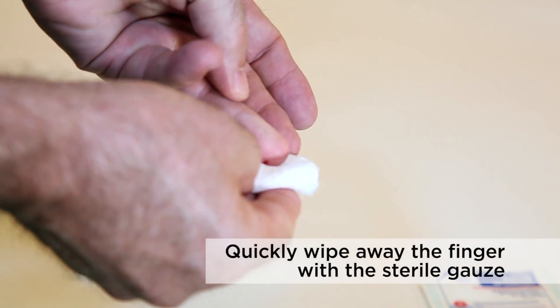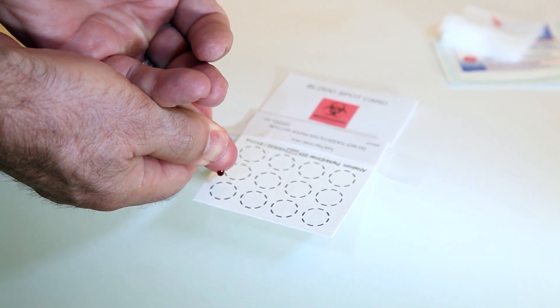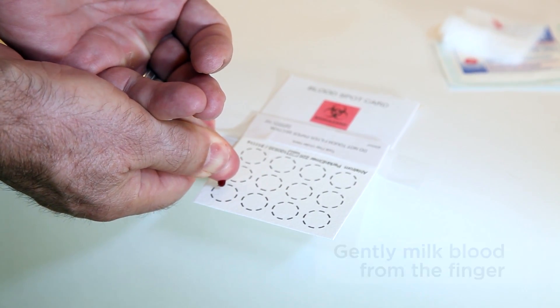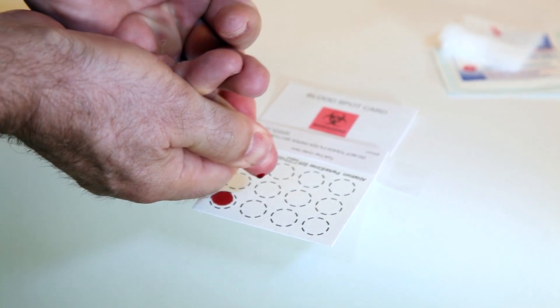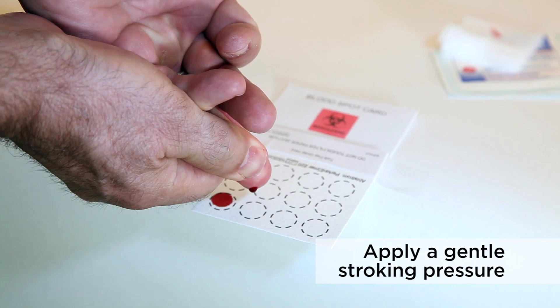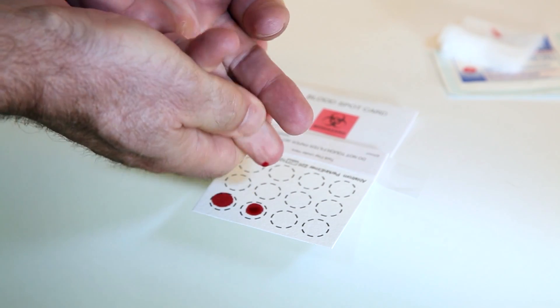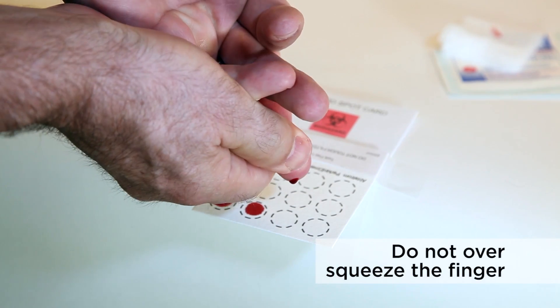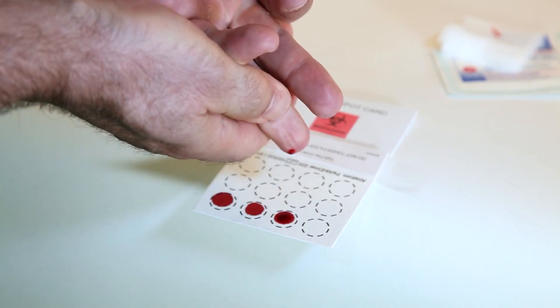Quickly wipe away the first drop of blood with the sterile gauze. Next, position the lancet finger over the blood spot card. Gently milk blood from the finger by applying gentle stroking pressure down toward the end of the finger that has been lanced. Do not over-squeeze the finger, as this can shut off blood flow and lead to an unsuccessful collection of blood spots.